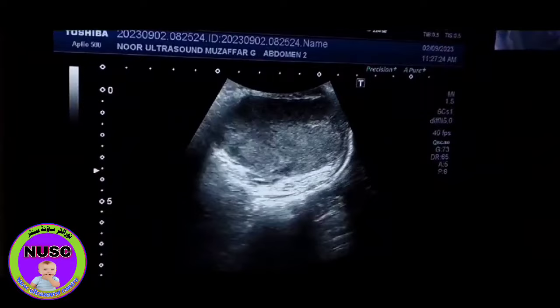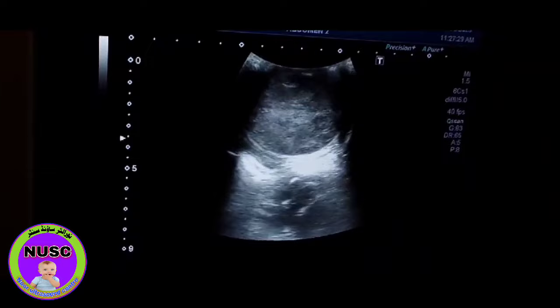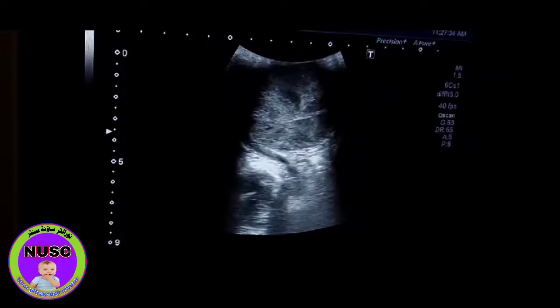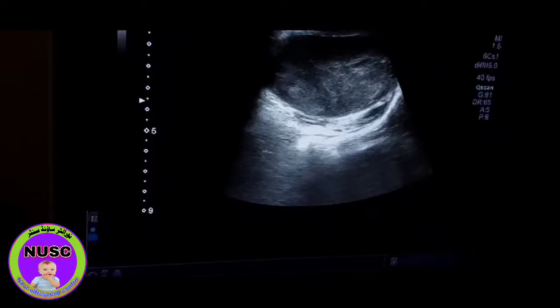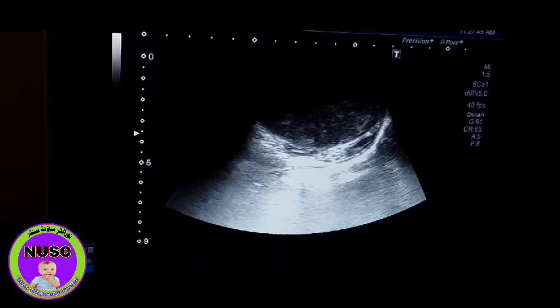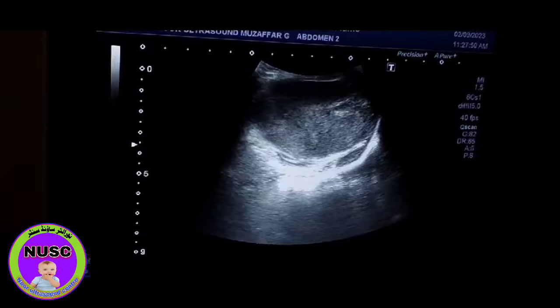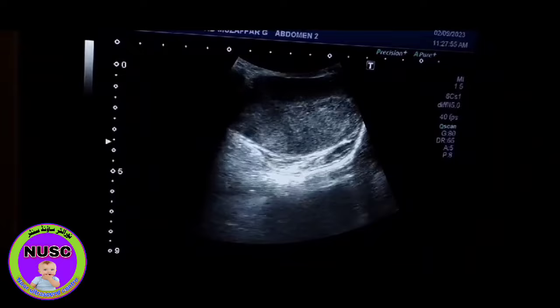Here we are performing a scrotal scan of a child of the age of about four to five years. He had some mass in the left scrotum a few months back, about three to four months back. And now there is again a mass in the left scrotum.